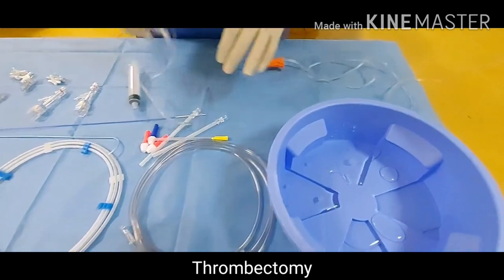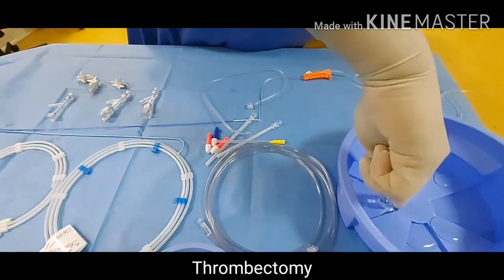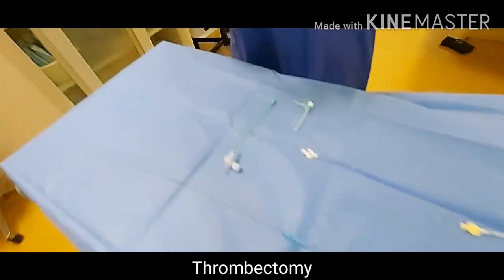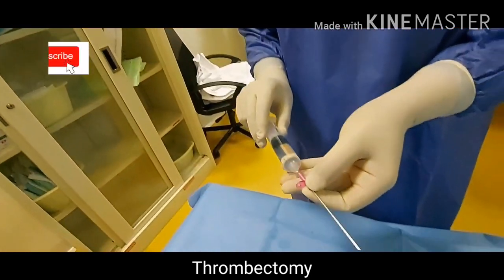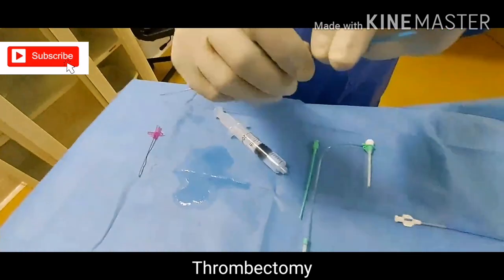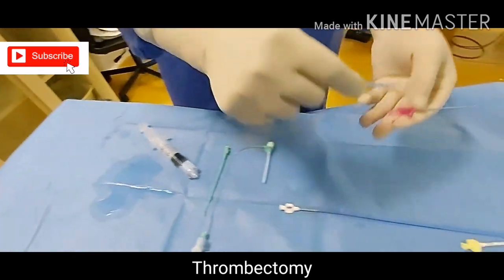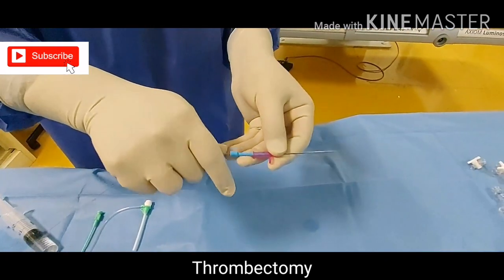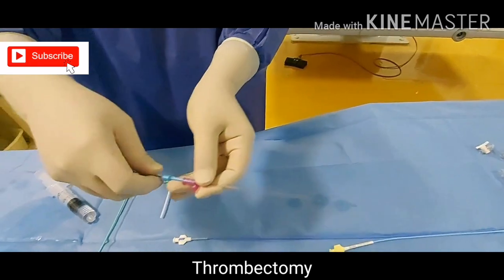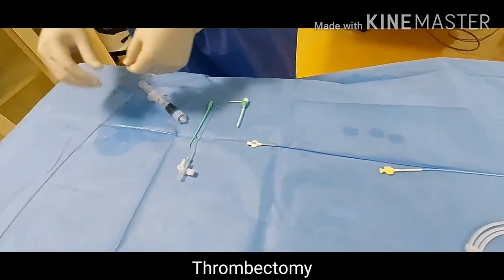Now the items we will use: first, the initial puncture needle. Every item we are using, we need to flush it properly. Then our short guide wire — make sure that your wire will go into the needle properly, because sometimes the needle gauge will be smaller than the wire.